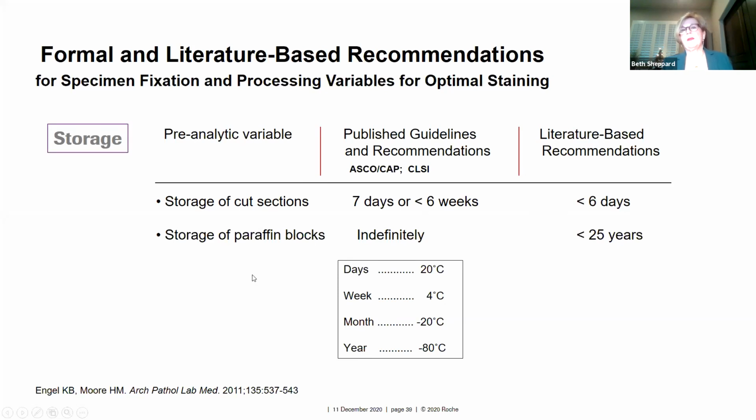But many times the package insert provided by the manufacturer will say what the cut stability of slides is for optimal staining. So I refer to the package insert also, because it's mandatory that you do cut stability to become a CE-IVD product.